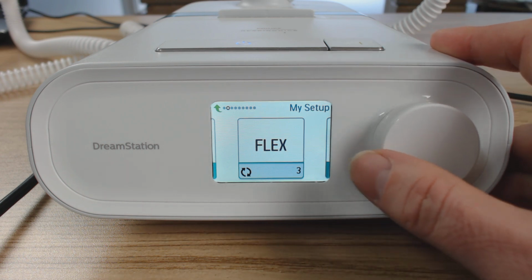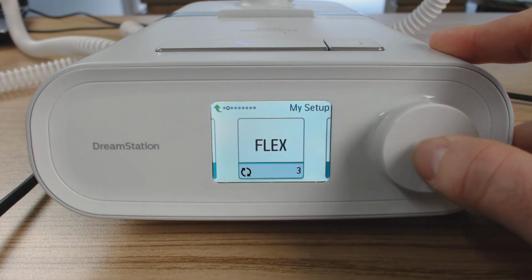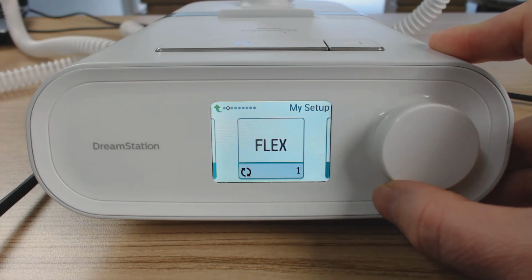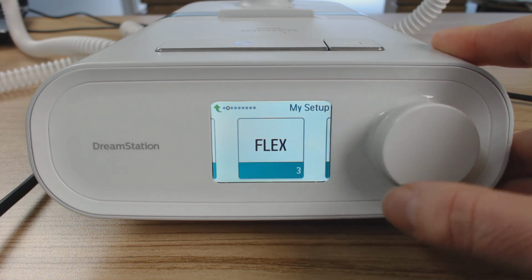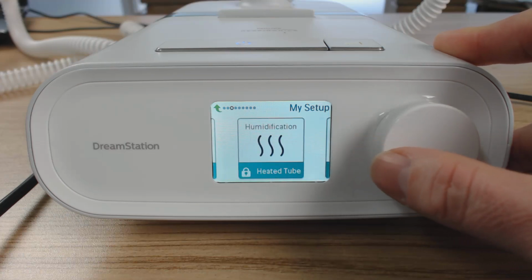So I recommend you just try them. Try it on 3. If you find that you don't like it, try it on 2, try it on 1. Or maybe start at 1 and go to 3, either or. Just try them out and see which one you prefer. Once again, you lock it in by clicking it in, rotate one to the right.